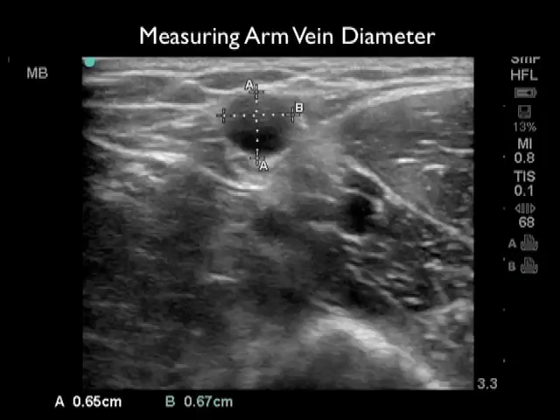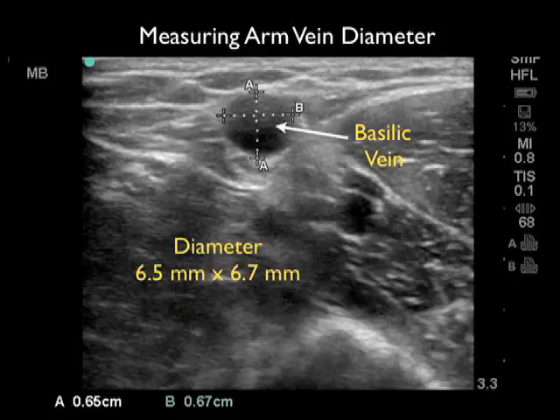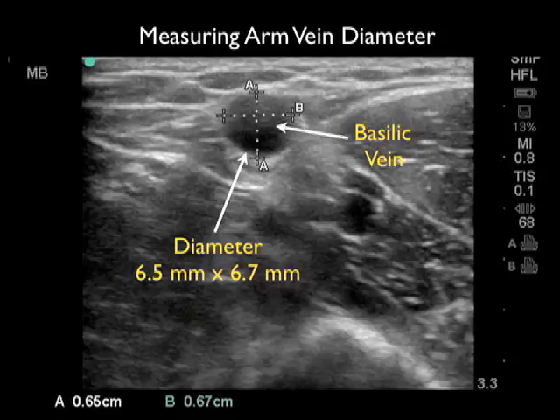Now let's take a look at a better target. This is a basilic vessel, and we can see that the diameter is much larger than the last brachial vein, measuring 6.5 mm by 6.7 mm. This would have a very high success rate in terms of cannulation with an ultrasound-guided IV. We can also see that the vessel depth is relatively superficial, again making it more amenable to a cannulation attempt.